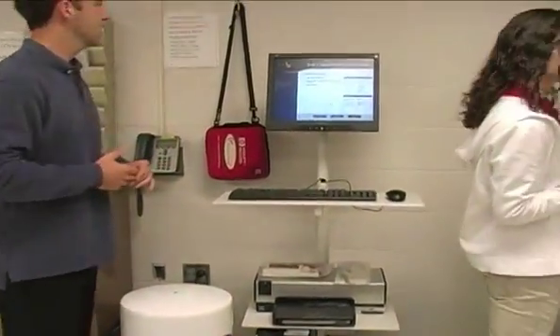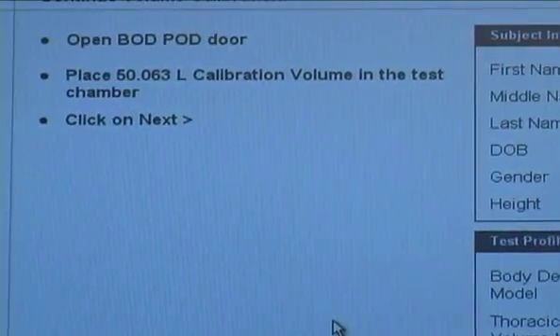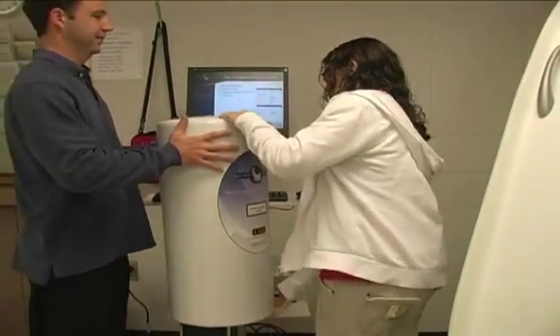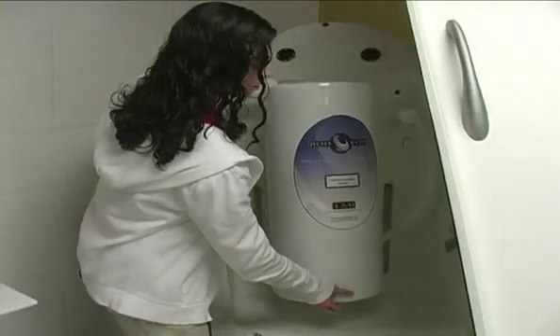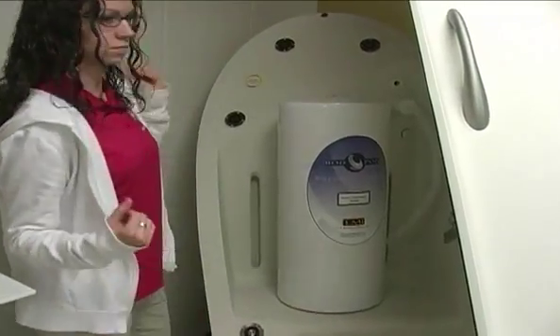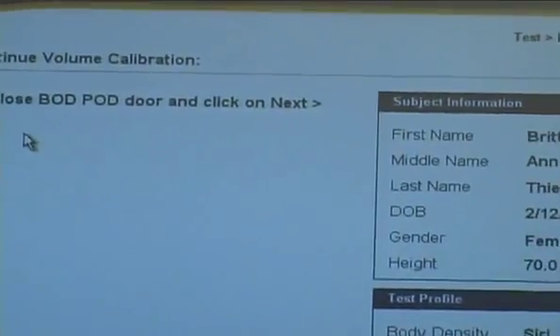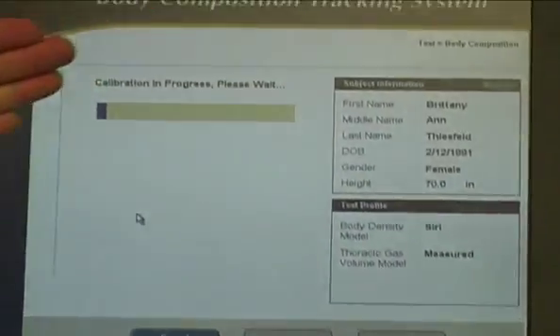So open door, it says, and then it says place the 50.063 liter calibration volume in the test chamber. And just so it's on the seat, so now it says, now close the door and click next. Next. So this will start the second point of the calibration, and then you have the progress bar.